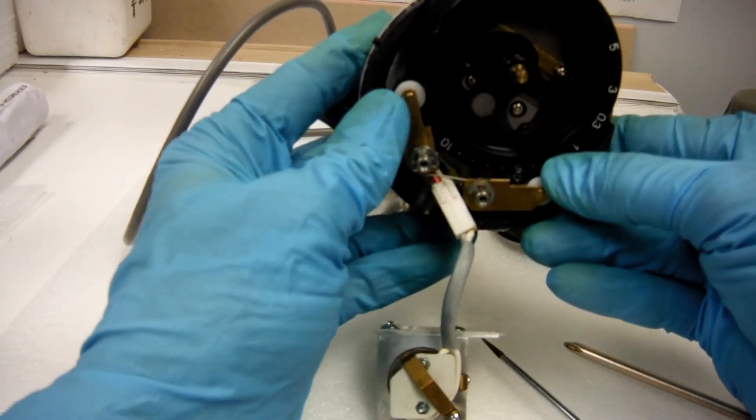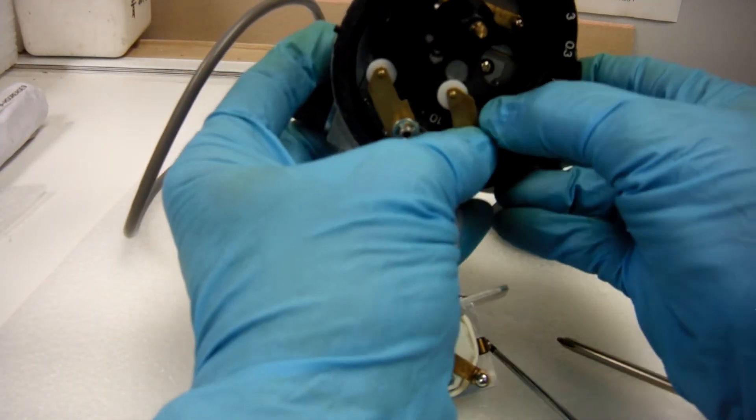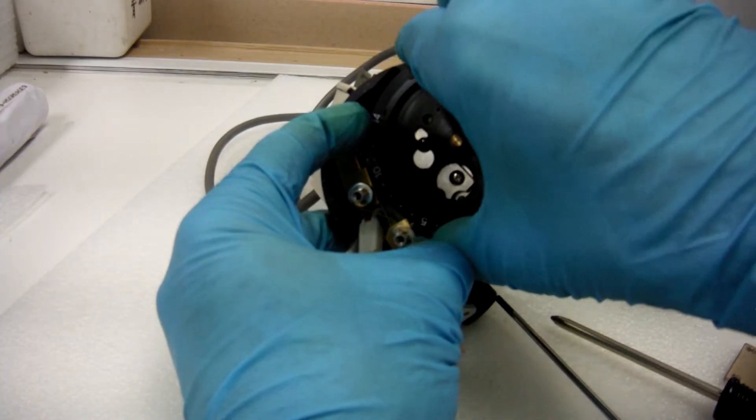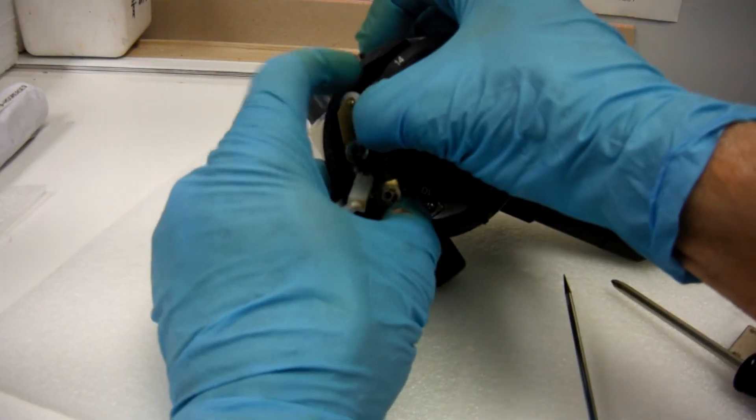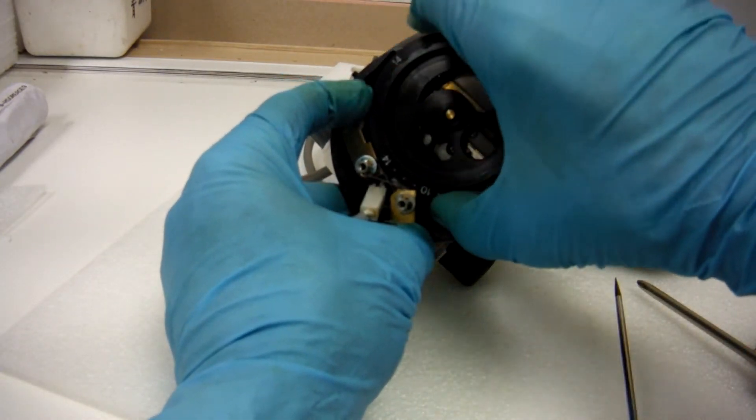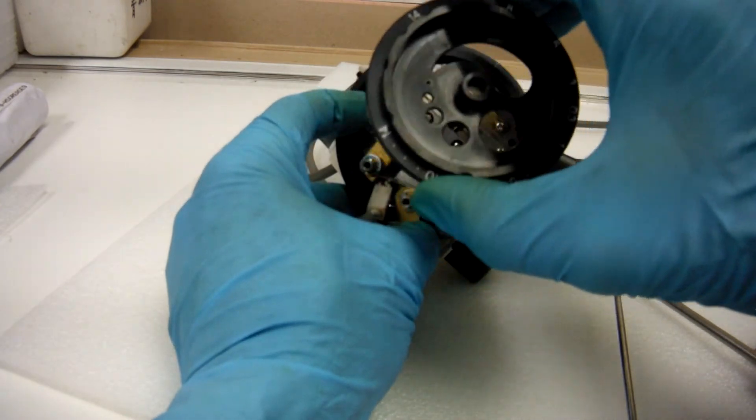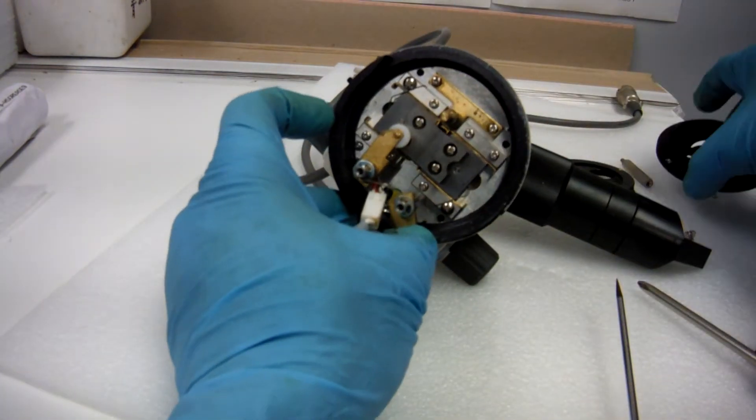To get the diaphragm wheel off you'll have to hold back the other arm at the same time. Pull that wheel off too. Might be a little tricky. You'll get it off.